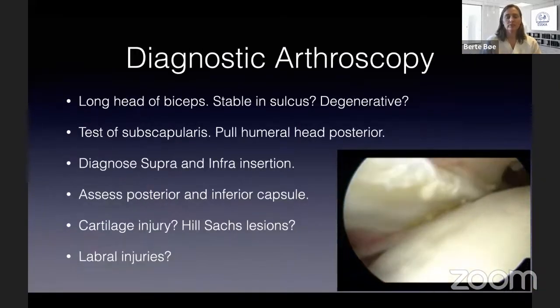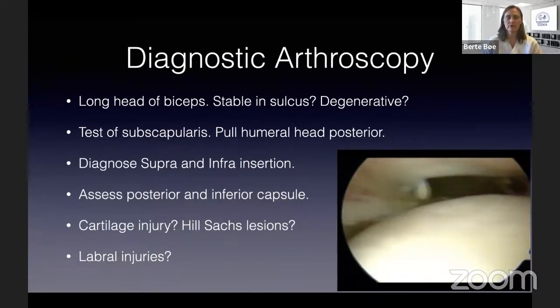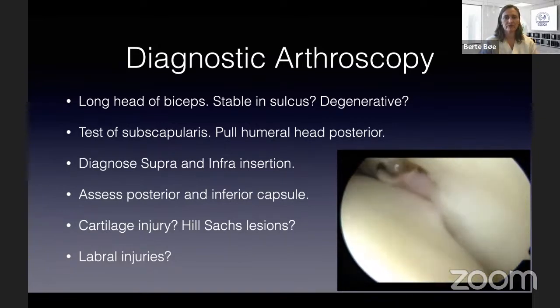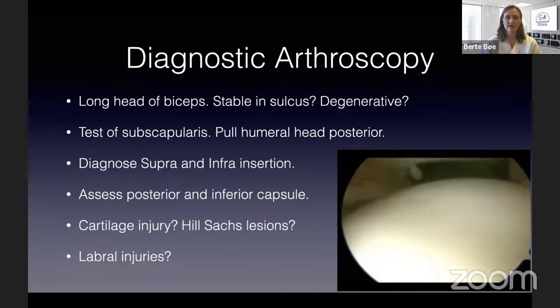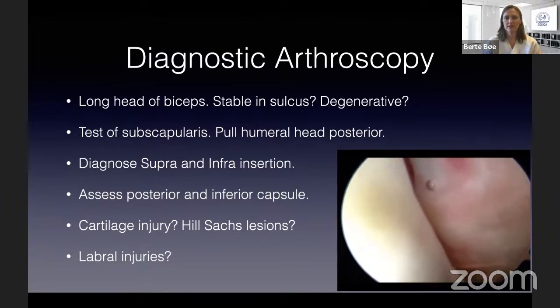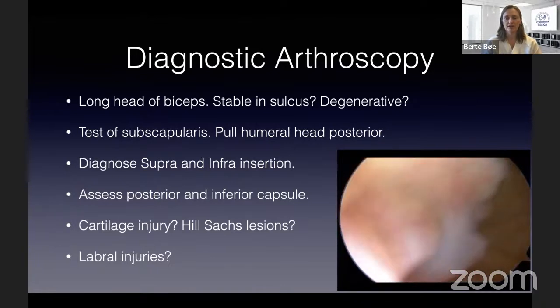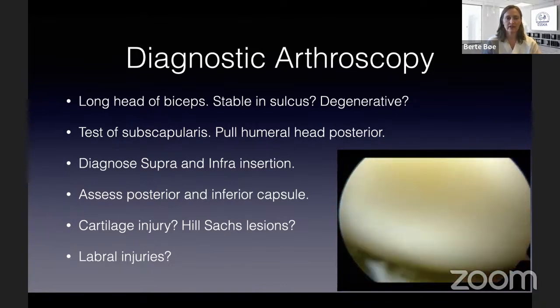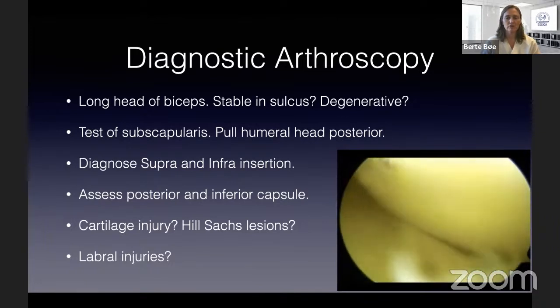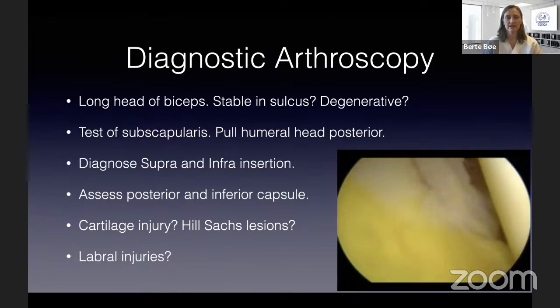So this is more of a technical lecture. When I am to repair the rotator cuff, the first thing I do, of course, is a diagnostic arthroscopy, where we inspect the long head of the biceps and move backwards to get an impression of the insertion of the supraspinatus and infraspinatus. Of course, we do a test of the subscapularis, which I will show you specifically in a later video.